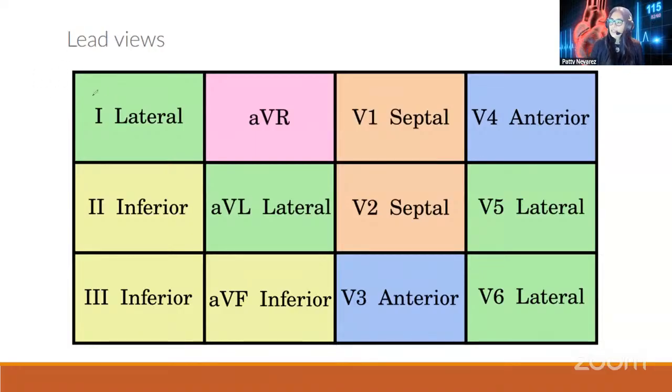So if we look at this here, look, we have bipolar leads, unipolar leads, and then we have the precordial leads on this side. Okay, that's great. But why is it important?